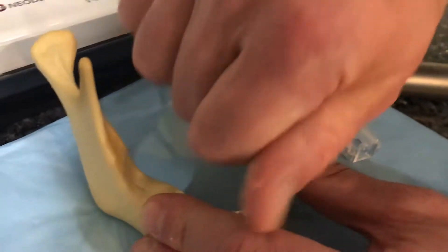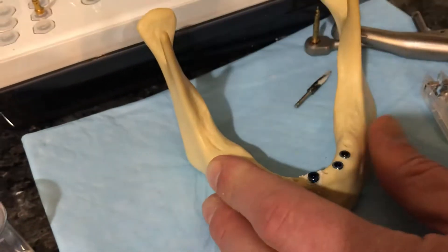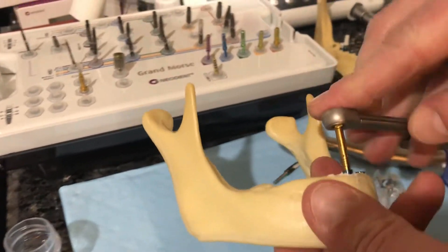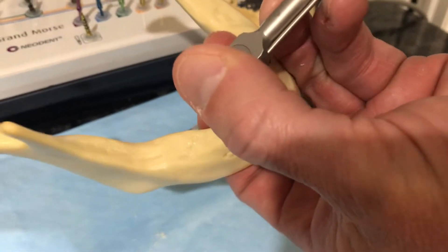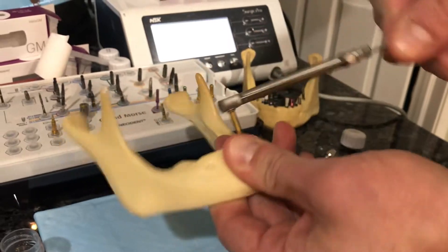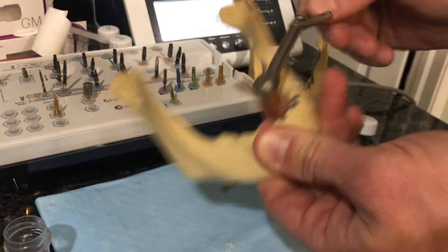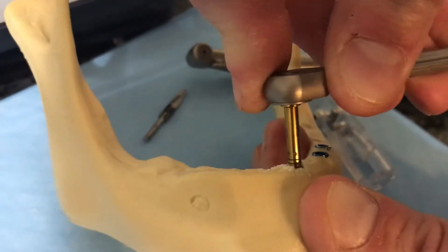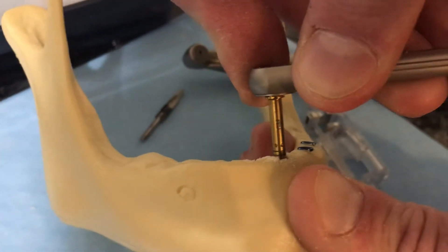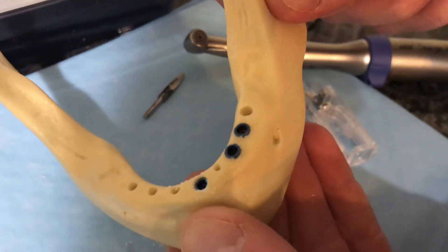Now the implant goes back in and it's going to be a little bit easier to seat it down. I finish it off with the wrench, making sure it's down and fully seated. I check the facial aspect for the dot and want to go just below the crestal bone level — just underneath the bone — for good placement.